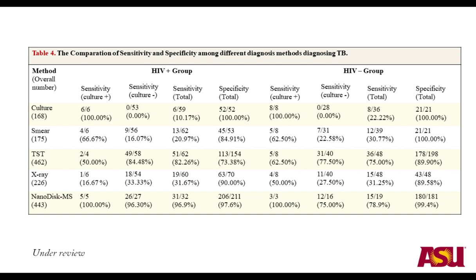99%. So here, this table shows the comparison between our method and others like culture, smear, skin test, and chest X-ray. So yeah, the method shows better sensitivity and specificity.